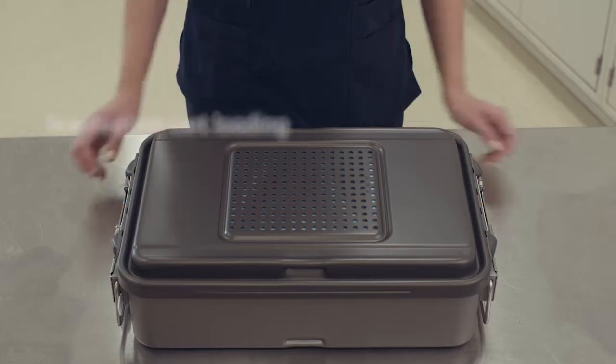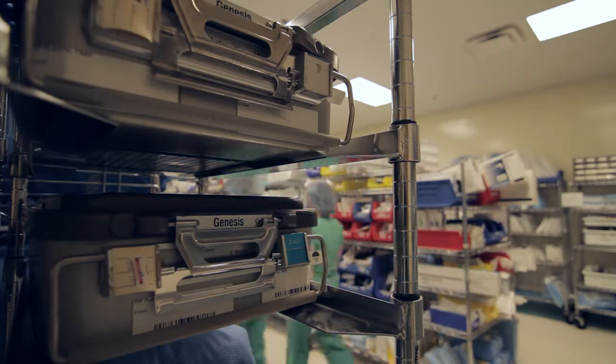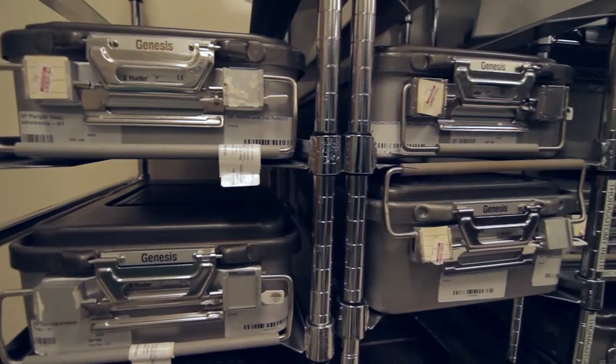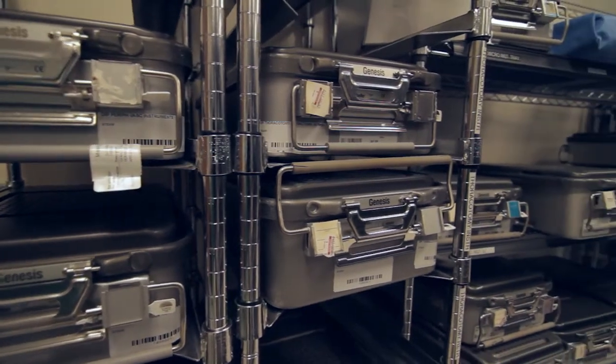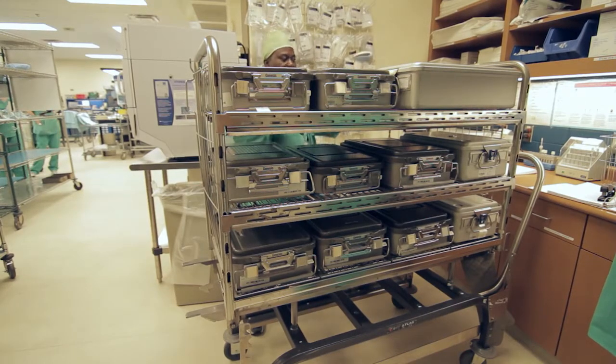When loading containers onto carts, always place the containers flat on cart shelves. Containers may be sterilized in dedicated loads or in mixed loads with wrapped and other peel-packed items. If sterilizing a mixed load, place containers below absorbent wrapped items.